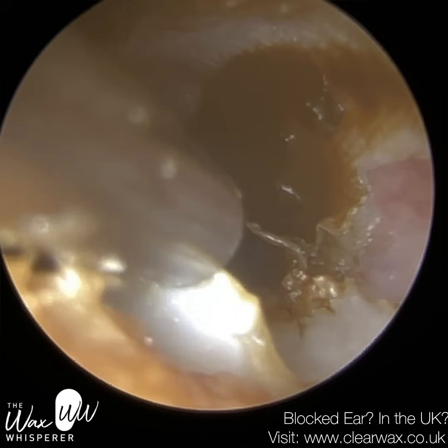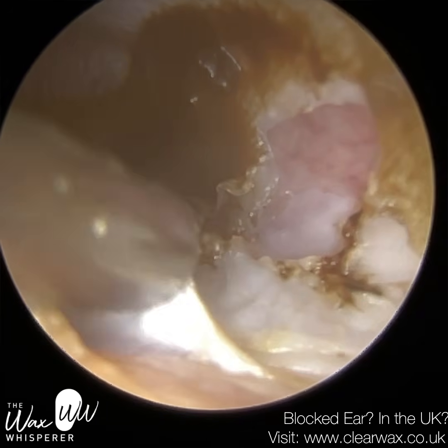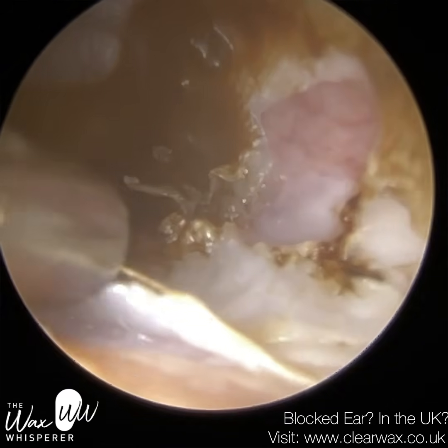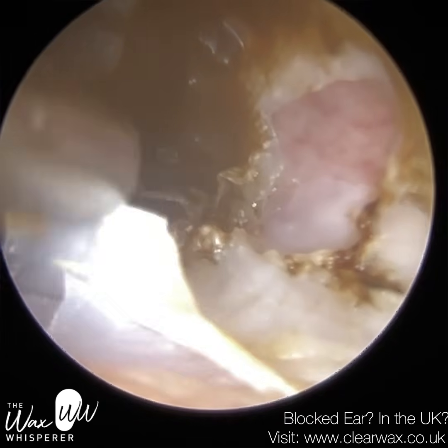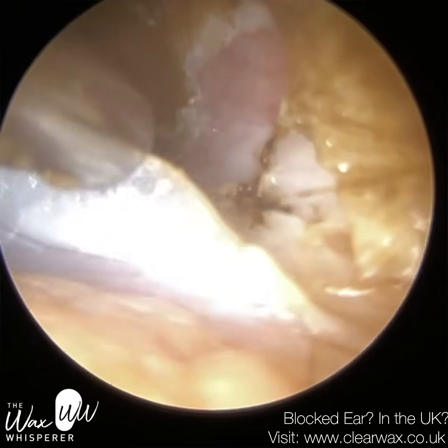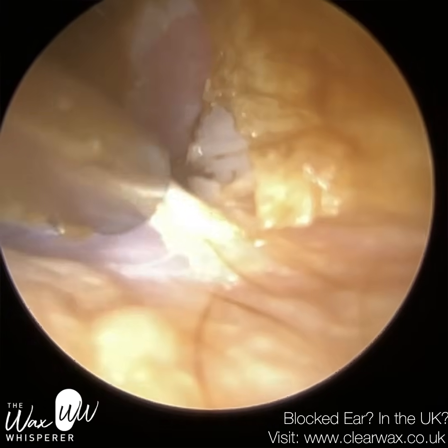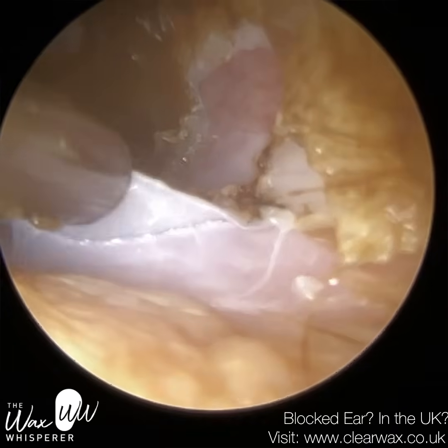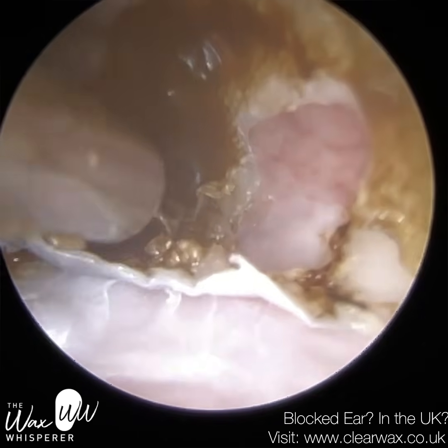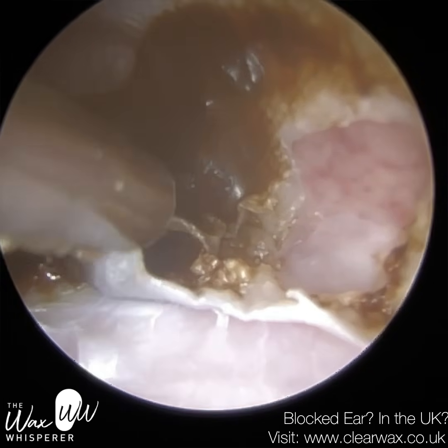And these are probably the trickiest of procedures to perform because there's very little margin of error. This layer of skin that I'm peeling away is probably, I would say, 0.1 millimeters in thickness. Of course, on the screen, on the camera, it looks extremely magnified, but it's a very, very thin layer of skin, and we're having to peel it off the canal wall. And of course, the canal wall, especially the bony part, the osseous section of the ear canal, which is the inner two thirds, is extremely sensitive, so we just don't want to make contact with that part of the ear.